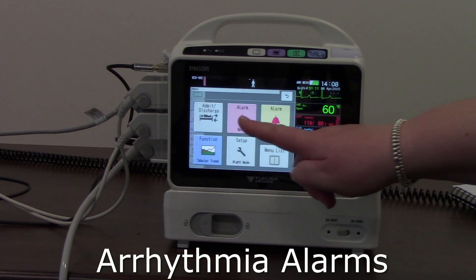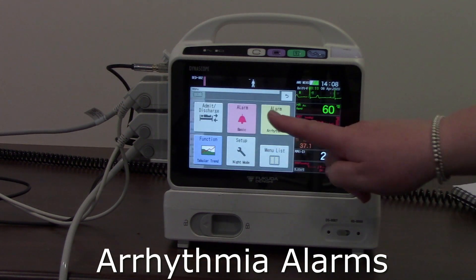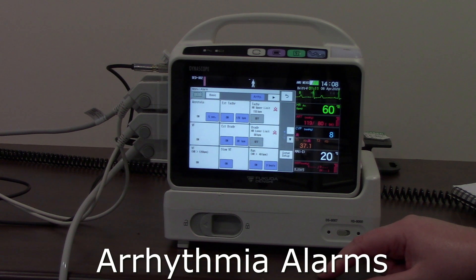That arrhythmia option is available via the alarm setup menu, but it's also available as a direct button on the menu as well — so there are multiple ways to access it.